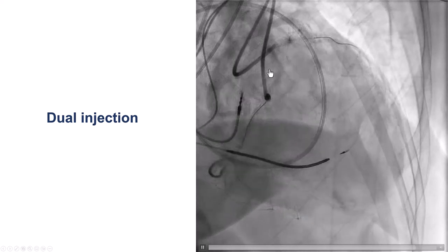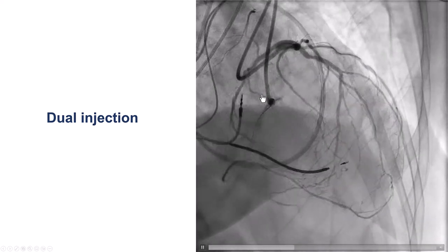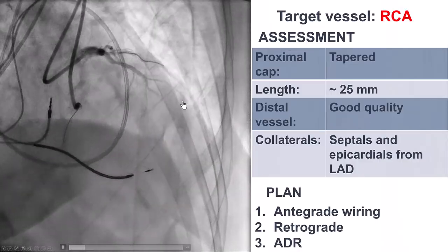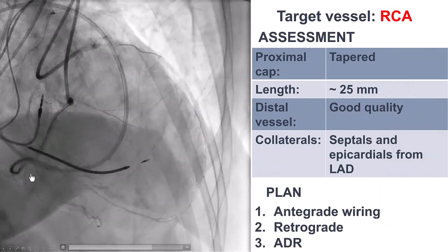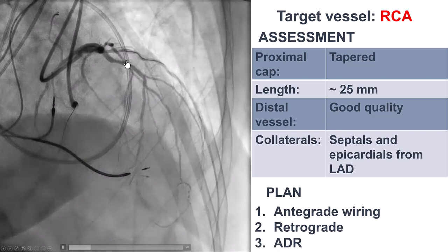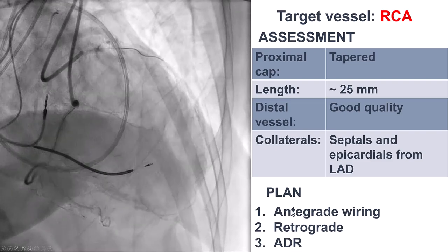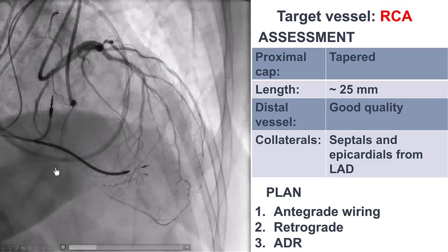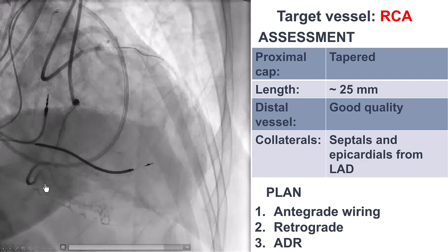We see here that we have engagement of the left main with the safety wire. There is a CTO of the mid-right coronary artery, and there is a tapered proximal cap. The distal vessel is of good quality, and there are both septal as well as epicardial collaterals going to the right coronary artery. Based on this, our plan was to start with antegrade wiring, and then if it didn't work, try to go retrograde through the septal branches, leaving ADR as a third option.